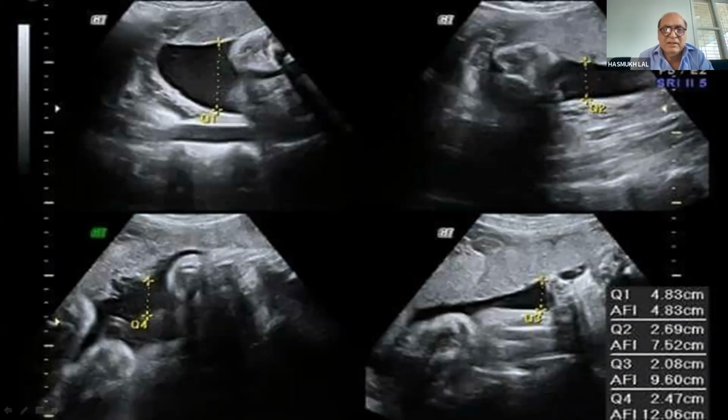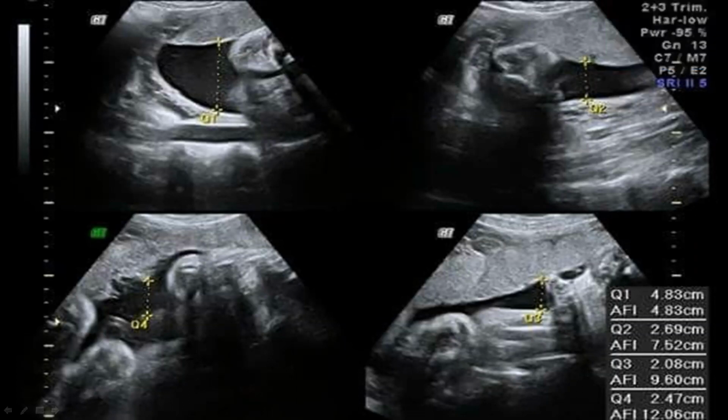Number 7, for estimation of the amniotic fluid, the transducer is held sagittally in 4 quadrants. So D is the correct answer, and 82% of our friends have replied right. There is an improvement from 60% during the pre-orientation questionnaire to 82%. Thank you. Good improvement.